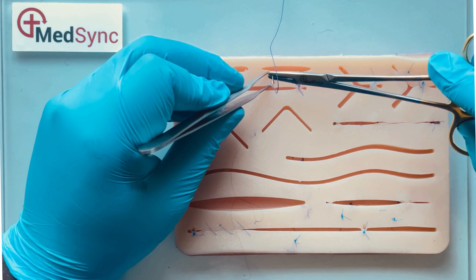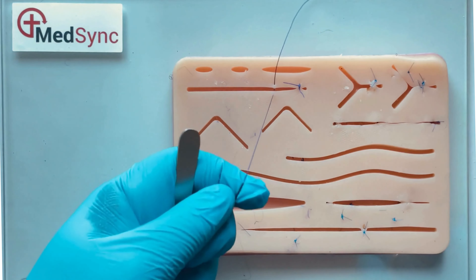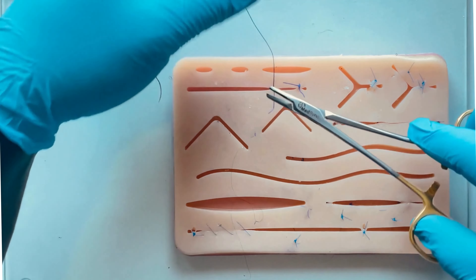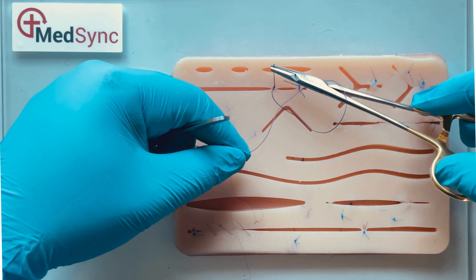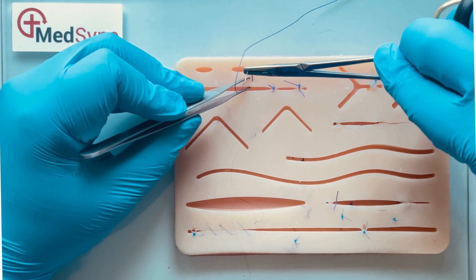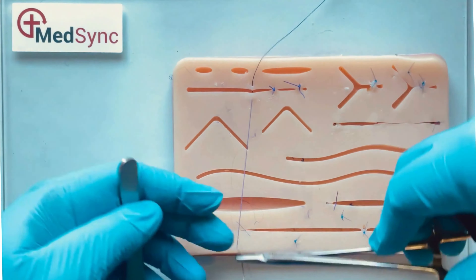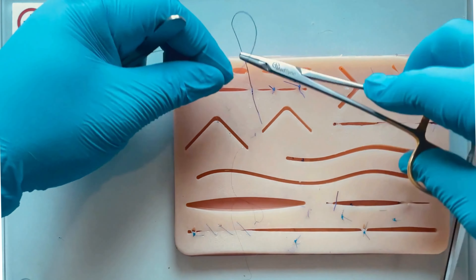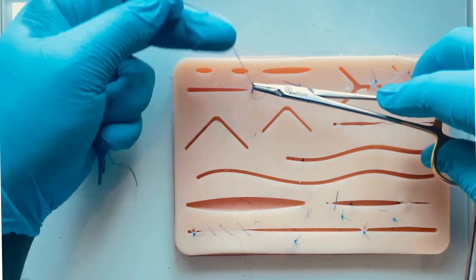Surgery should look effortless, from the way you hold your forceps to how you pass your suture through the wound edges. When tying your knot, you do not need to apply maximum strength — simply enough force to bring the wound edges together, dermis to dermis, epidermis to epidermis. Hold your forceps so you have control. The needle holder should be mounted on the pads of your fingers, not at the base, and allow your wrist to rotate following the curve of the needle in its entirety. When you tie a knot, keep the short end around 2 cm long, and hold the long end reasonably close to the wound bed.